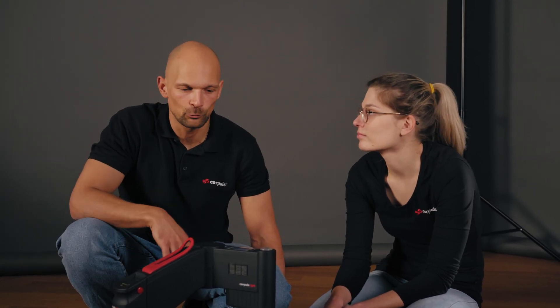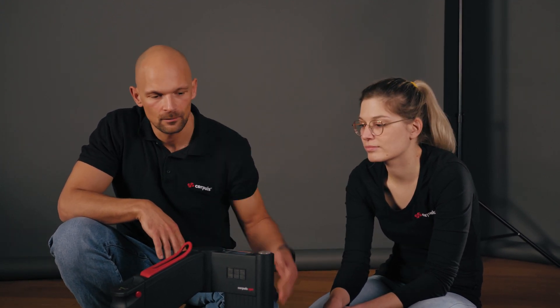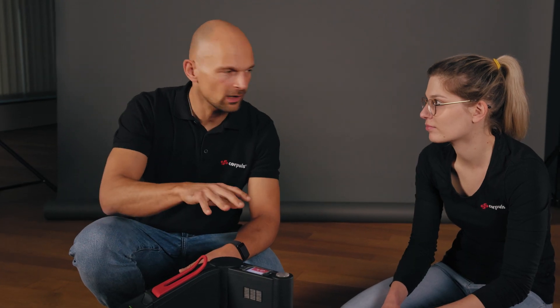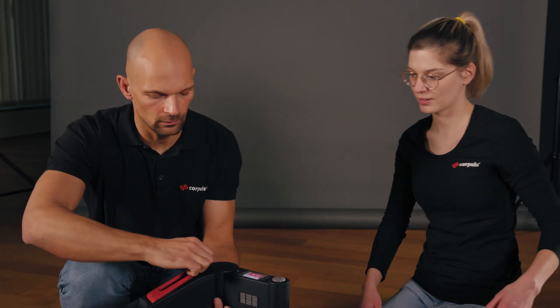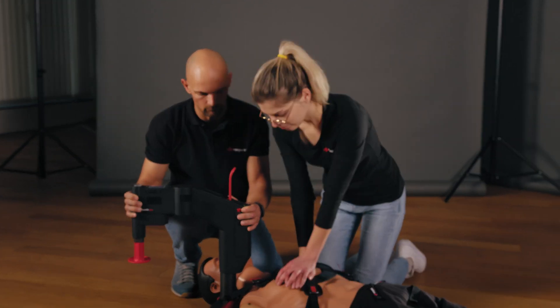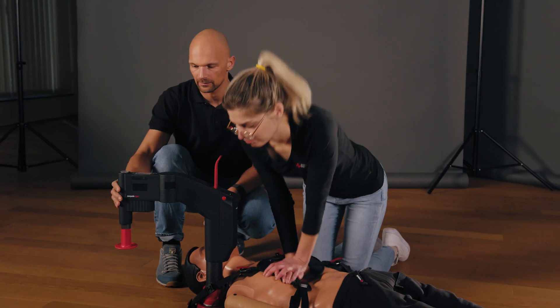Those are the most common alarms and their possible solutions. Now we show what to do when an alarm occurs that cannot be solved immediately. When a red alarm with a high need for action unexpectedly occurs, get ready for manual compressions, swivel the device away, and calmly assess what the problem is while continuing compressions manually.